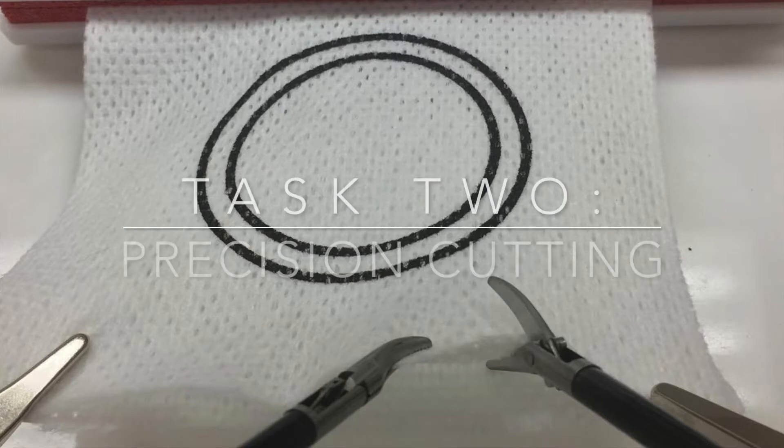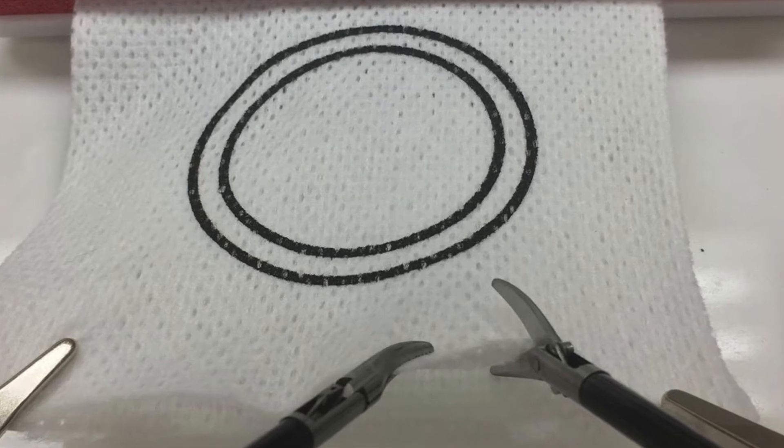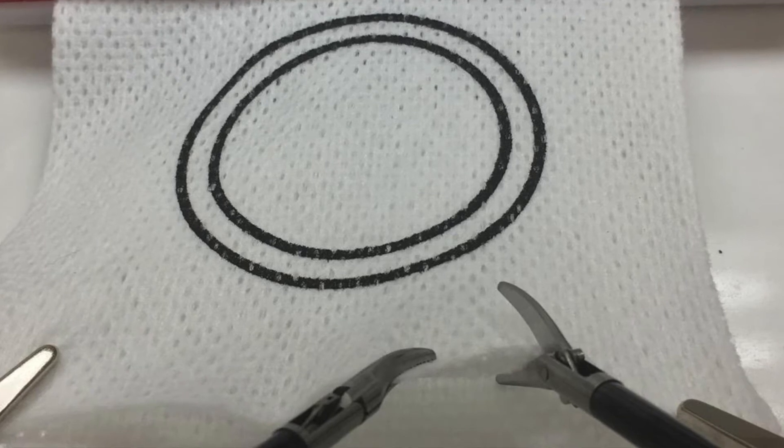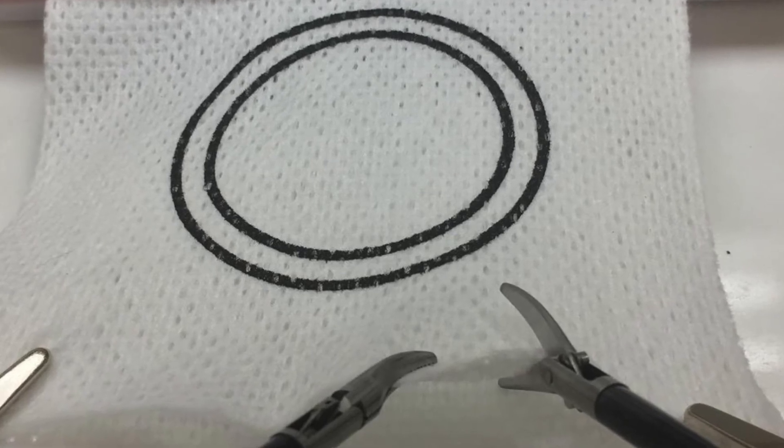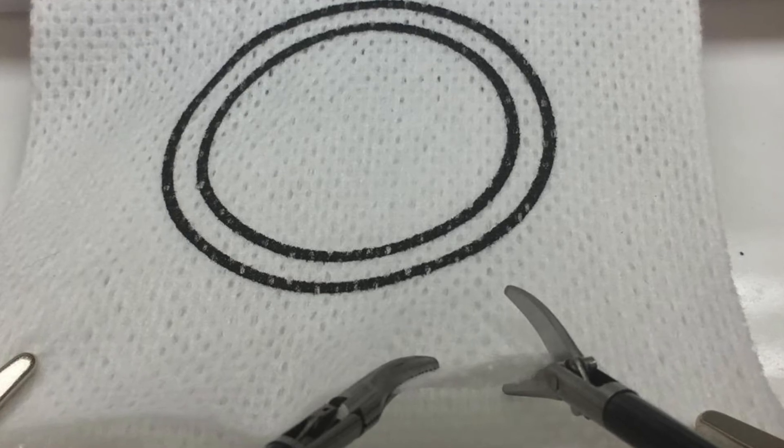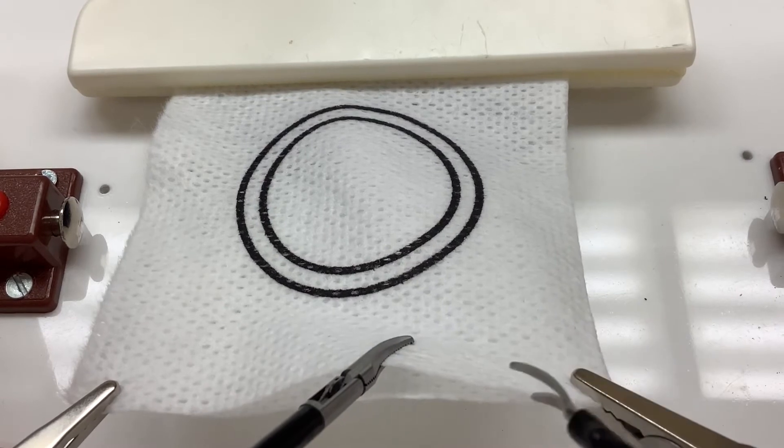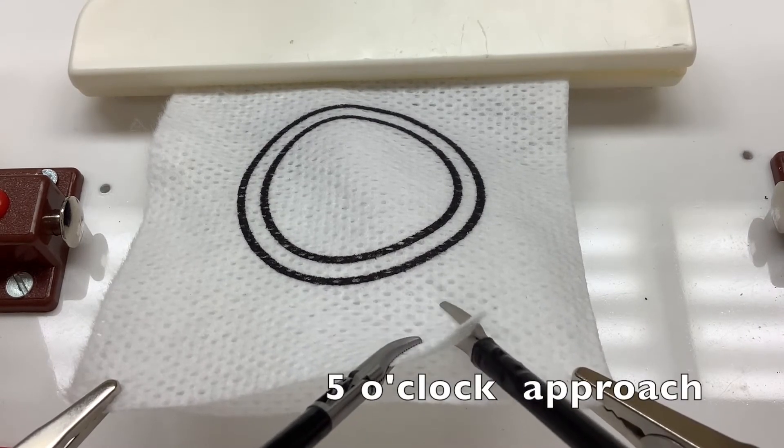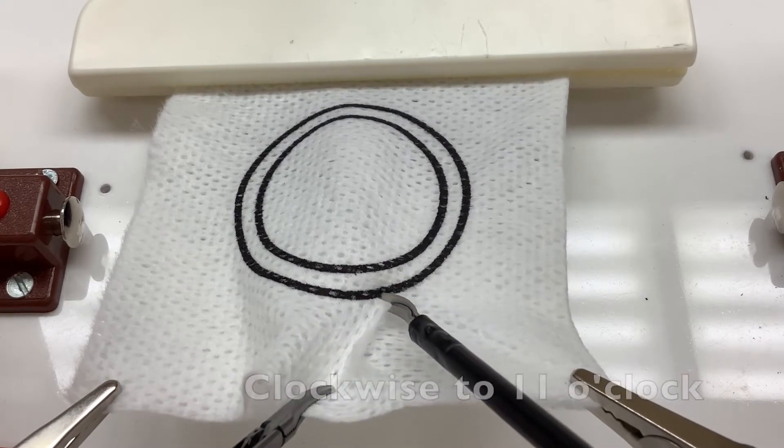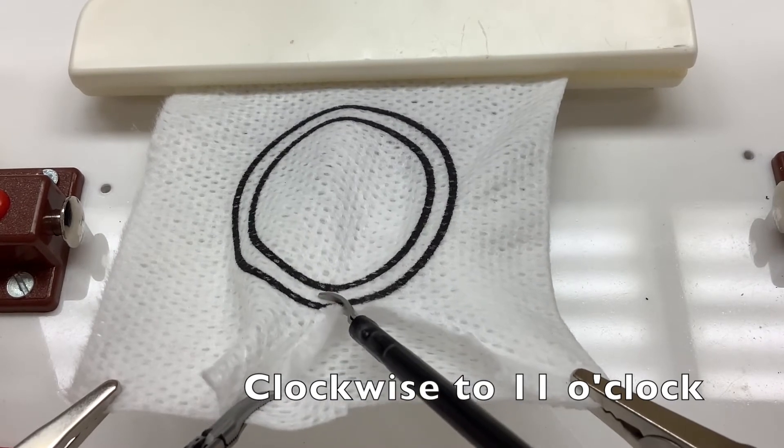Task 2, Precision Cutting. The actual exam utilizes only one circle. We recommend directly cutting on the black lines when using the practice gauze to simulate real testing conditions. We recommend approaching the circle from a 5 o'clock position. In order to cut a continuous edge, partially close the blades of the scissors and maintain both blades along the incision.